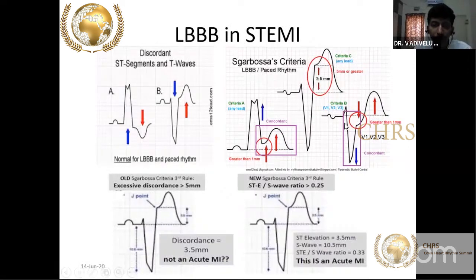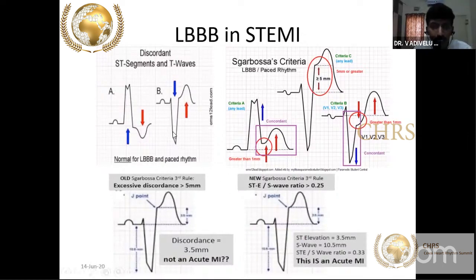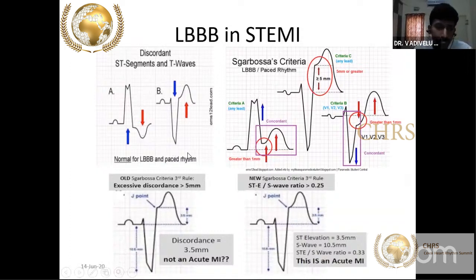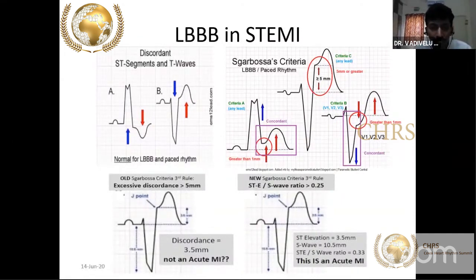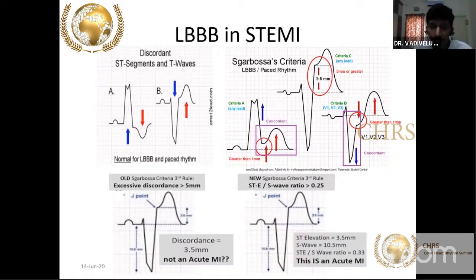Remember three criteria for left bundle branch block presenting as STEMI. The most important is concordant ST segment elevation — if the QRS is upright, the ST segment should also be elevated. Concordant ST segment elevation of more than 1 mm is sufficient. For discordant criteria to merit an ischemia point, the ST segment elevation should be more than 5 millimeters.